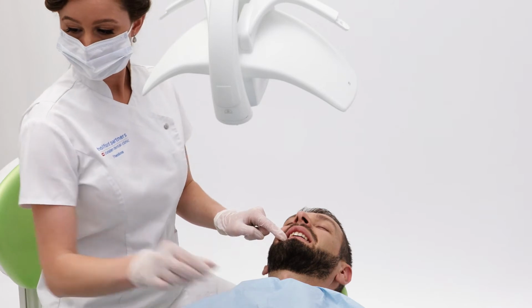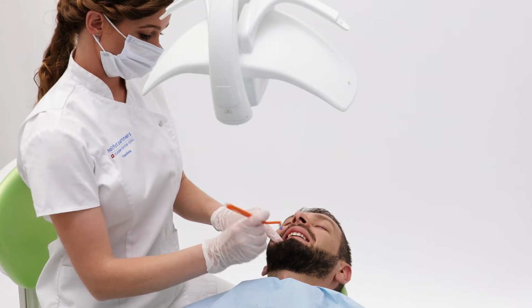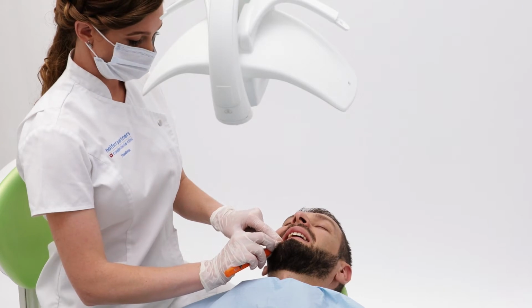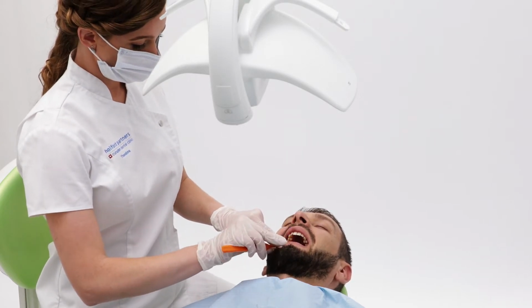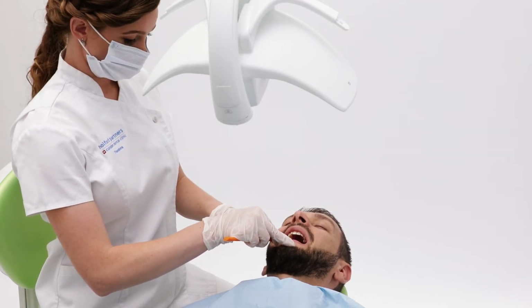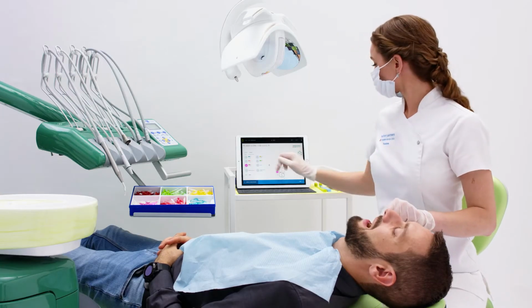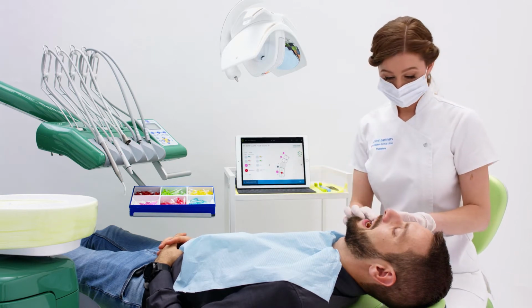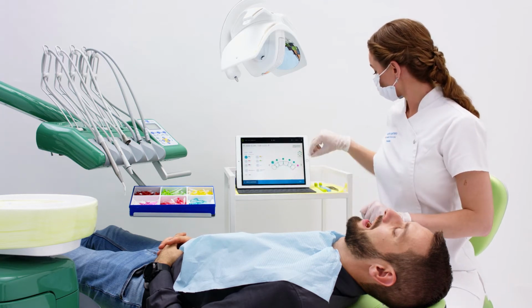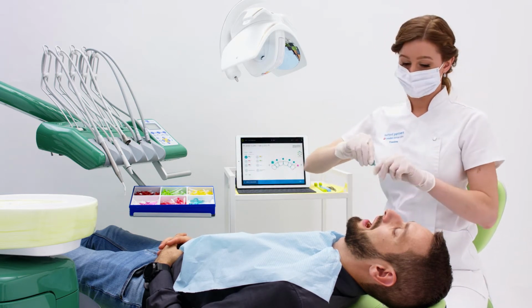I also use a single tufted brush in this sextant, as Edward has a large interdental space here. I input this brush into the Bob score by clicking the Others button, which appears then as a grey circle on the chart. I continue onto the upper anterior sextant and check the colours from the IAP are a correct match with that of the brush.